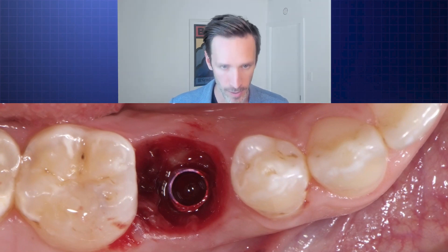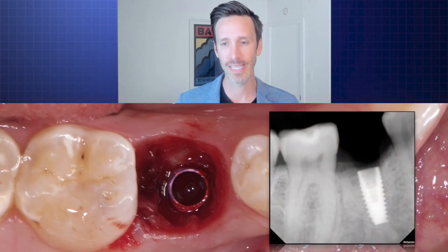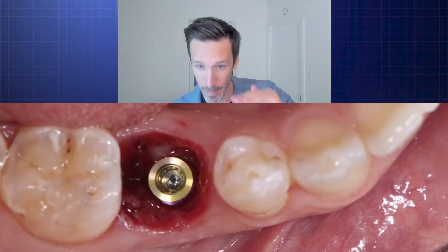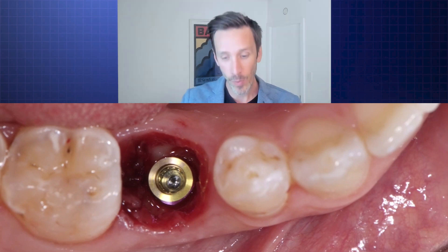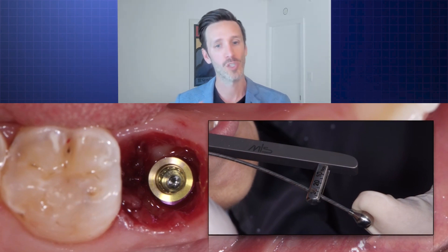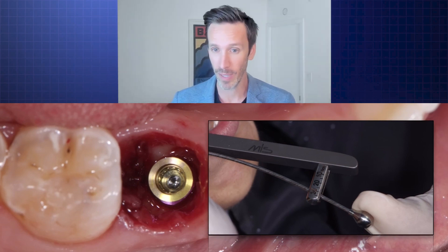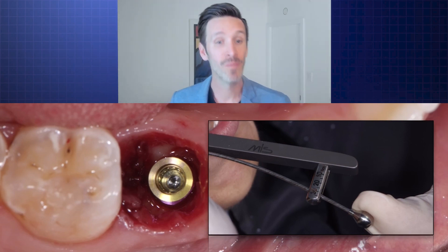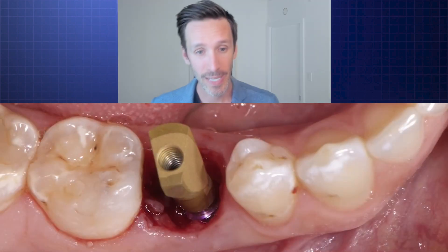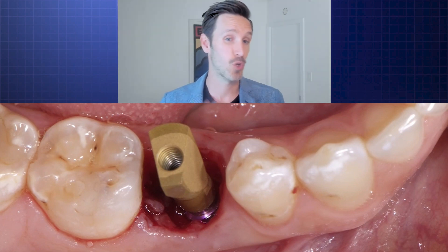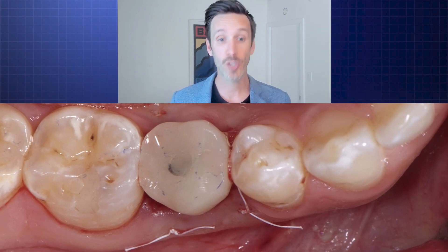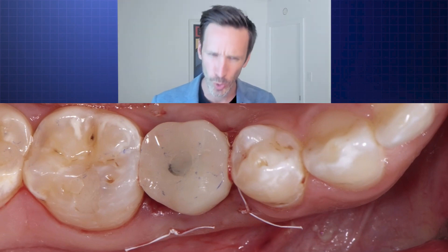I placed my V3 implant — traditional implant placement right at bone level, or here we're a little subcrestal, as you can see in this radiograph. Now this is where the workflow changes. I put in the stay-in abutment and because my implant had good stability, I was able to torque this down to 30 Newton centimeters. The goal is that I will never remove that. So I've transitioned this to kind of a tissue-level implant, but I still have all the surgical flexibility and restorative flexibility of bone level. We attempted to place the scan body and were going to try to do this in two appointments — placing the implant, then a few months later placing the final restoration. The contacts were good; I did have to adjust the occlusion slightly.